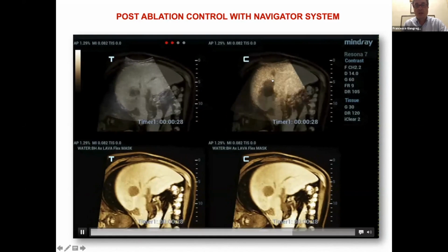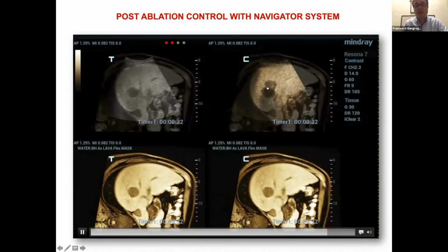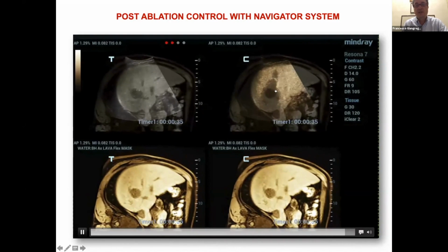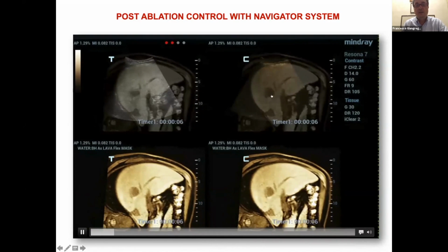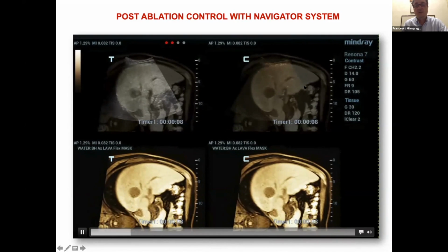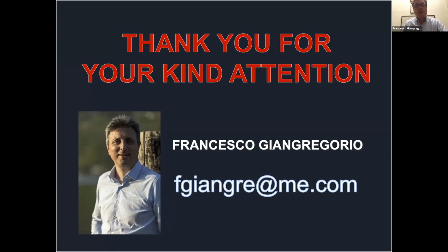So also in this case, in a few seconds, you can say that we have obtained a safety halo, and we can say that this nodule was efficaciously treated. And with this last slide, I thank you for your kind attention.